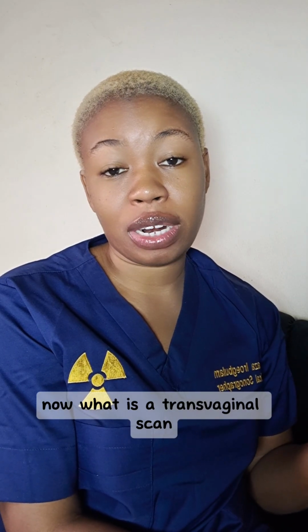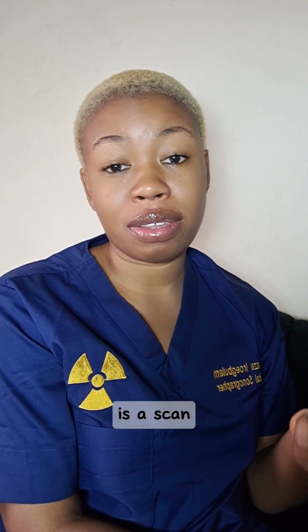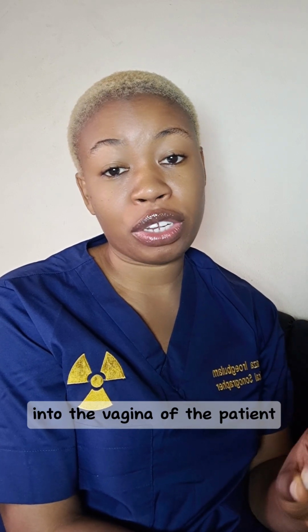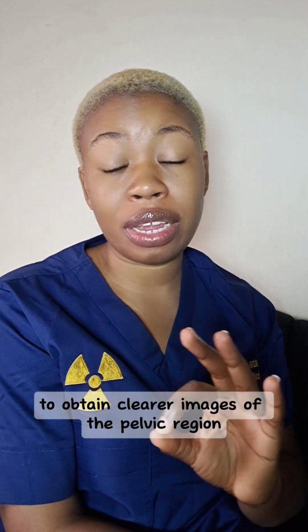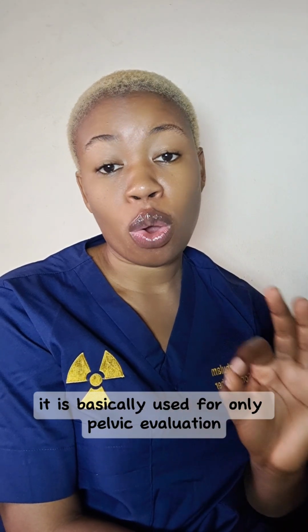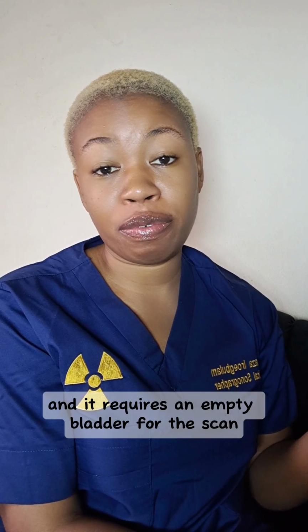Now, what is a transvaginal scan? A transvaginal scan is performed by inserting a high-frequency probe into the vagina of the patient to obtain clearer images of the pelvic region. It is basically used only for pelvic evaluation, and it requires an empty bladder for the scan.